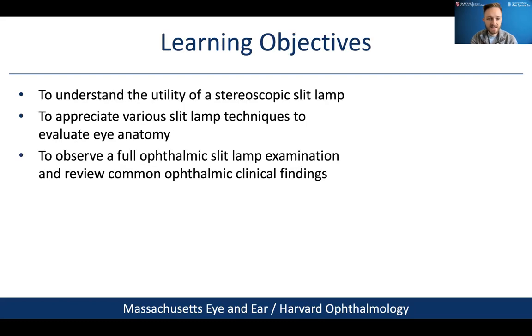Learning objectives for today are to first understand the utility of a stereoscopic slit lamp. Second, to appreciate various slit lamp techniques to evaluate eye anatomy. And third, to observe a full ophthalmic slit lamp examination and review common ophthalmic clinical findings.